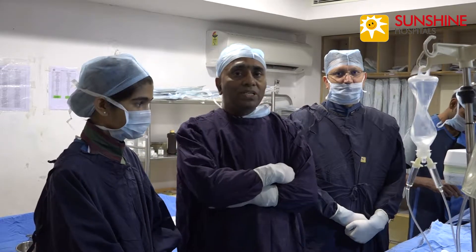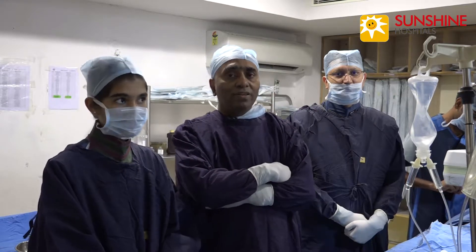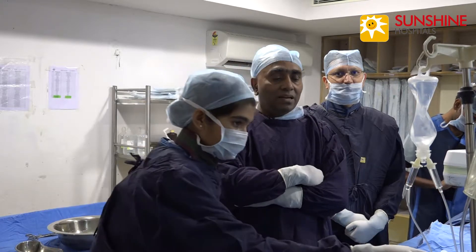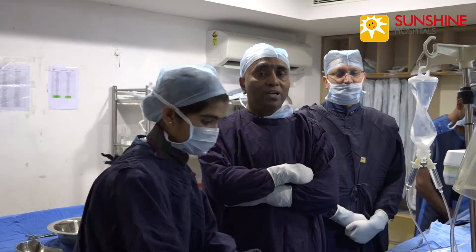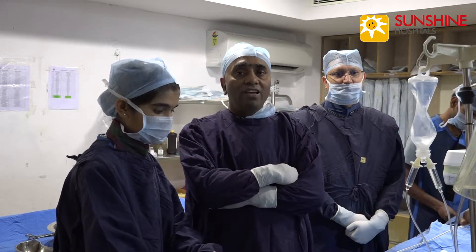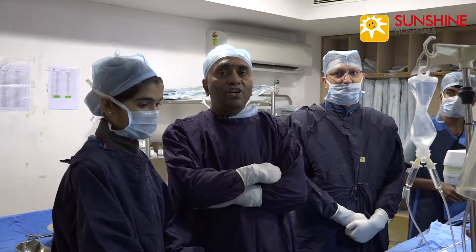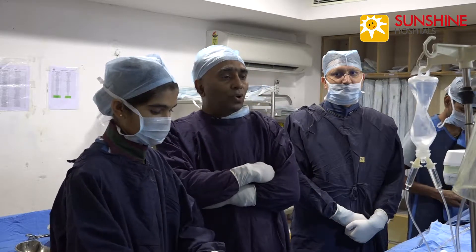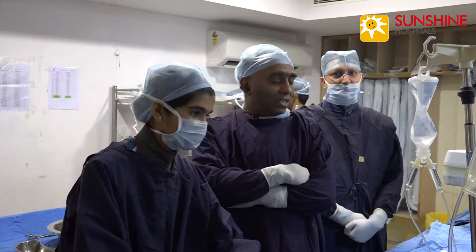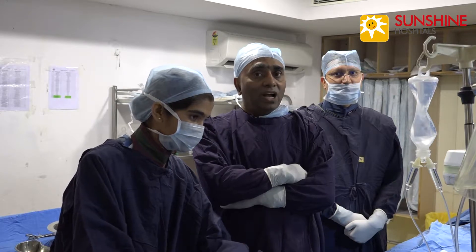This patient, Mr. Ravinder, is having acute deep vein thrombosis involving the right external iliac vein. This patient has a high degree chance of developing acute pulmonary thromboembolism, which is a very fatal condition. To avoid this, we are putting in an IVC filter, which is the latest one. We are going through the left femoral vein because this patient has got thrombosis in the right external iliac vein.